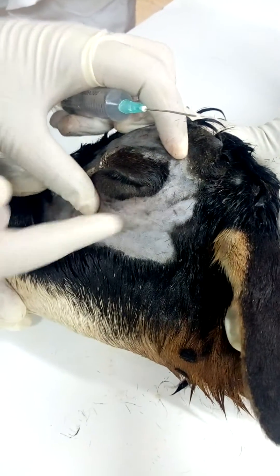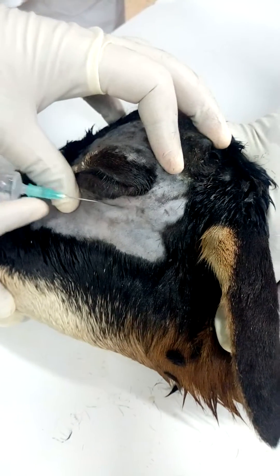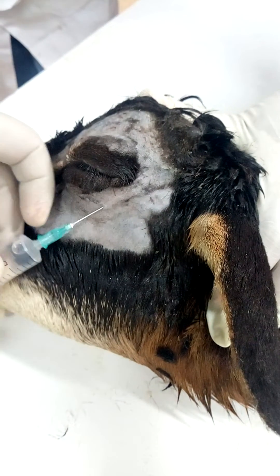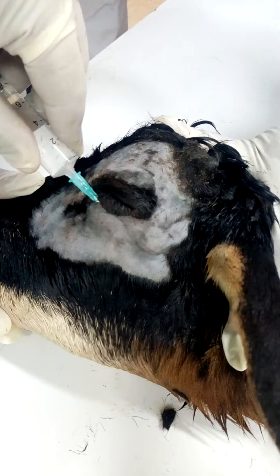We have to inject the drug here to desensitize the eyelids. Just when we are injecting, you have to make it a fan shape in order to cover the area.